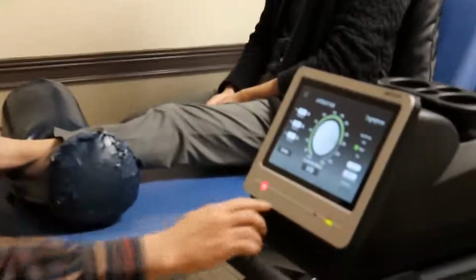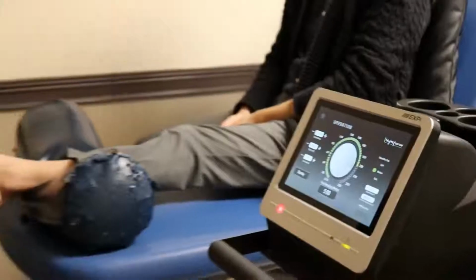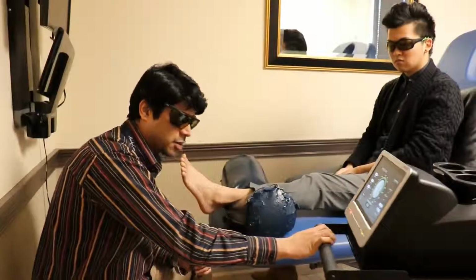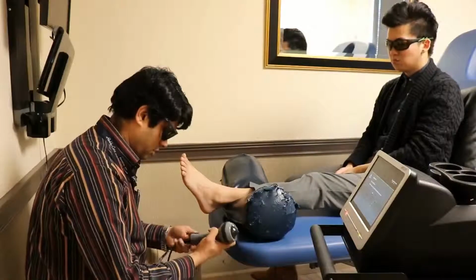It's going to take 5 minutes, so it doesn't always take long. People who actually come in expecting 15-minute sessions may or may not happen. It depends on the body part and what condition we're dealing with. A lot of factors come into play with that. So you ready, Anthony? Yes.